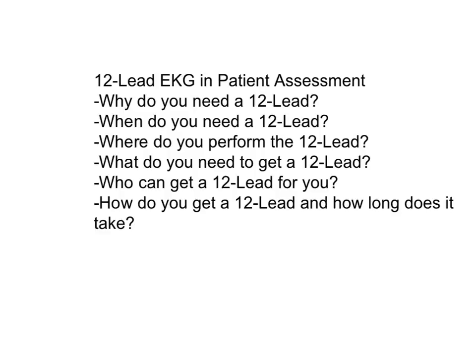Why we're doing this, we're going to do several more of these presentations about the specifics of analyzing a 12-lead and all the information that you can obtain. We're looking at 12 leads for evidence of injury, ischemia, or infarct. We're also looking for conduction delays. We're also looking to get an excellent view at what the actual rhythm is. In some cases it's difficult to tell from one lead, but you can certainly get a better look when you get 12. So that's just kind of the start of several in a series on 12-lead EKGs.